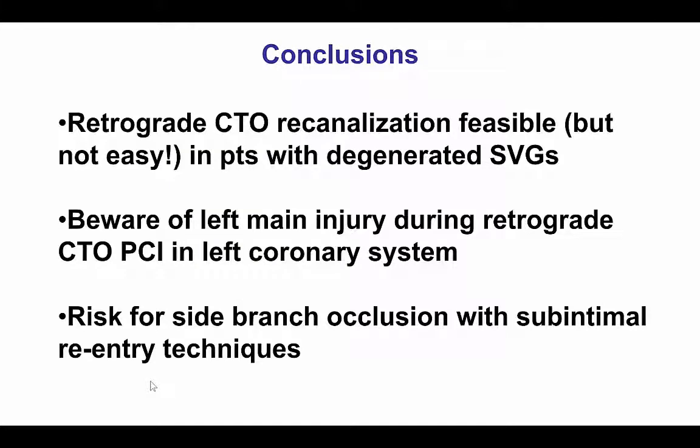In summary, this case shows that patients who have degenerated saphenous vein grafts may sometimes be treated by opening the native artery CTO, as was the case here. However, these cases are not likely to be easy. The distal cap in patients who have bypass grafts tends to be harder than if there is no bypass graft because of the higher pressure, making it a very complex procedure.